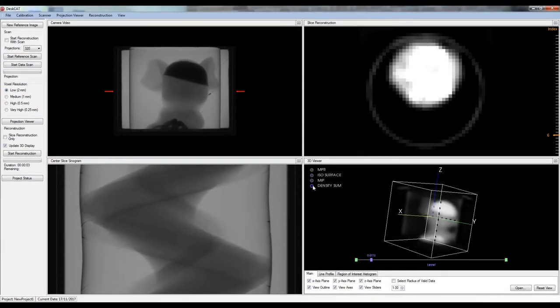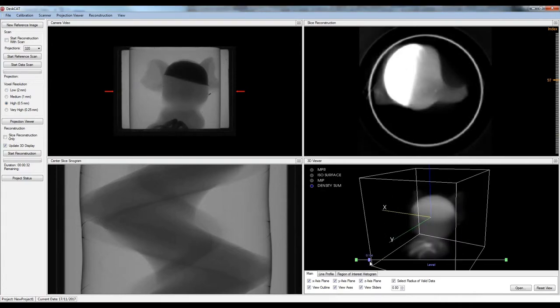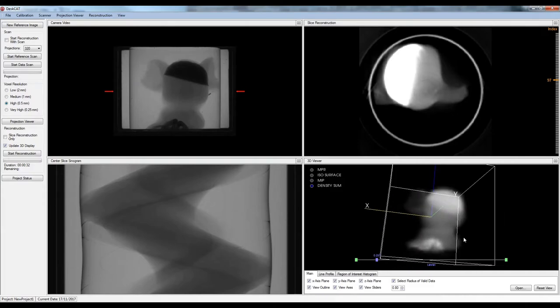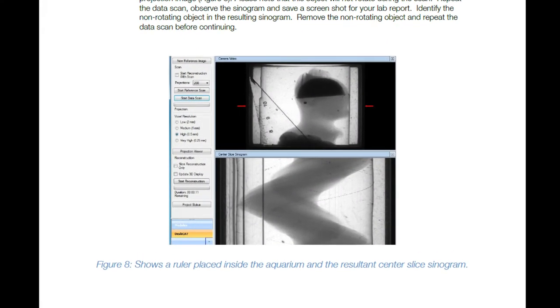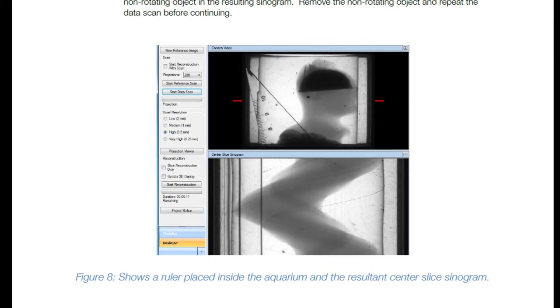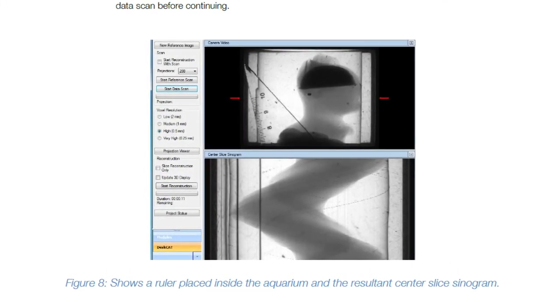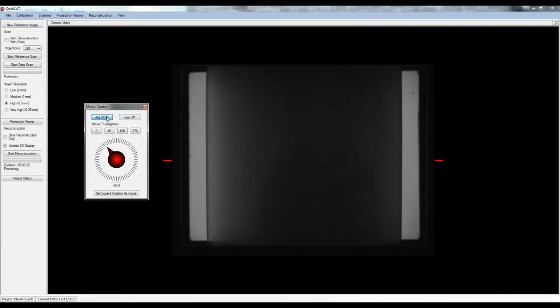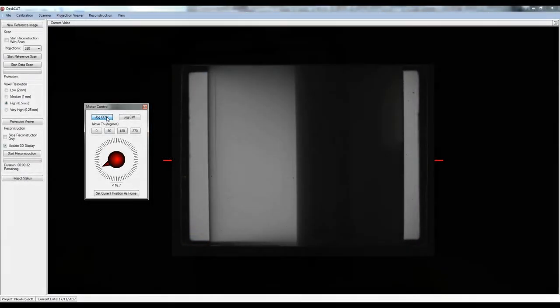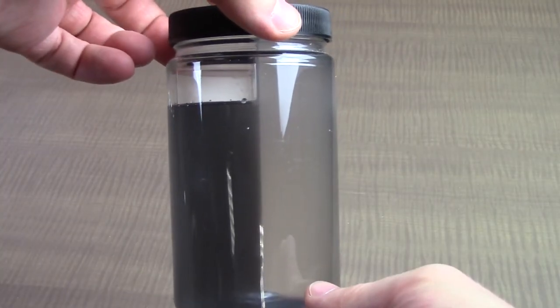and density sum. The software allows students to simulate motion of objects during data acquisition by using software displacement of sinogram data. An example would be to use a small target suspended in the scanner to emulate the intrascan sinusoidal vertical movement with variable amplitude and period. Denoising techniques using iterative reconstruction can be demonstrated by a half-moon edge phantom.